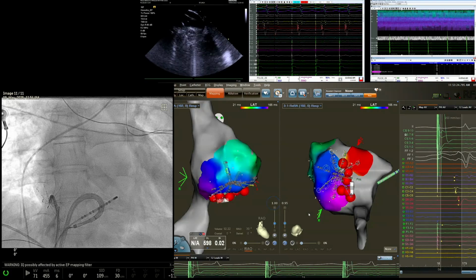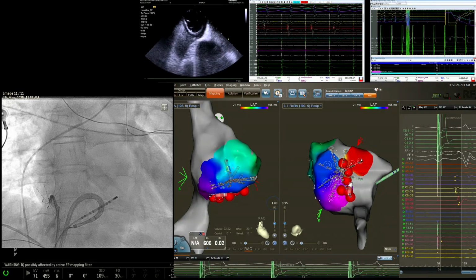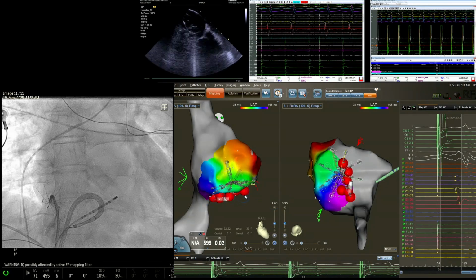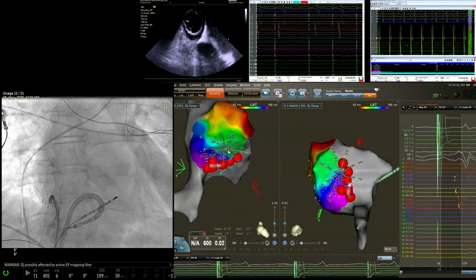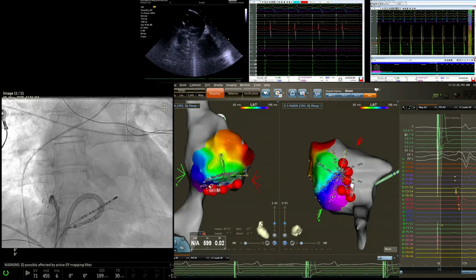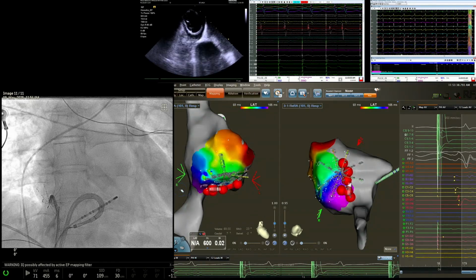And you can see how fast it is, again, with our clunky workflow. It's lightning fast. Now, one more thing, and this is a really important point. So right now, we're at 4.5 minutes, okay? The last lesion was how long ago? Well, probably like a minute ago. So it'll be like a minute and a half.